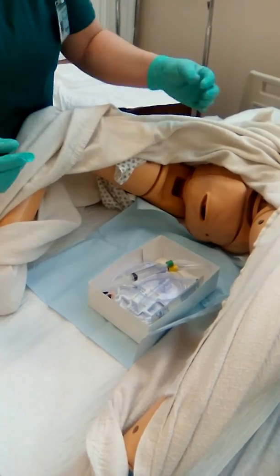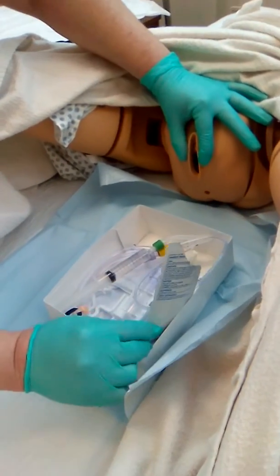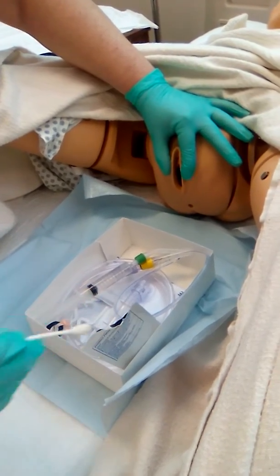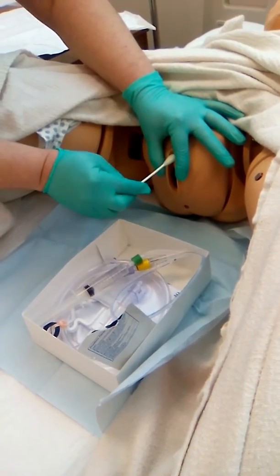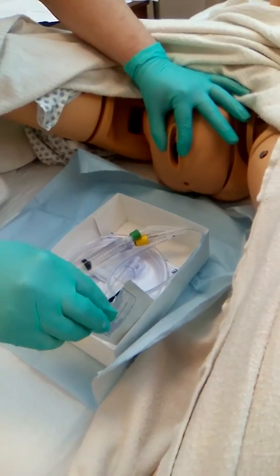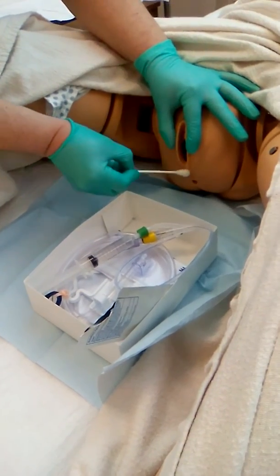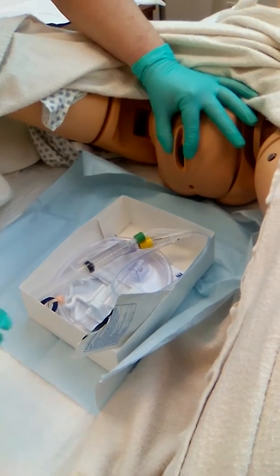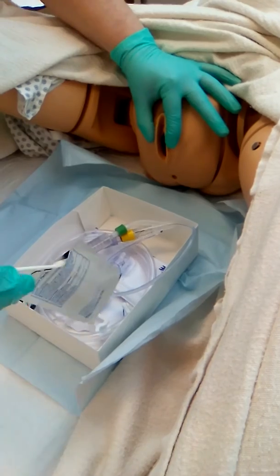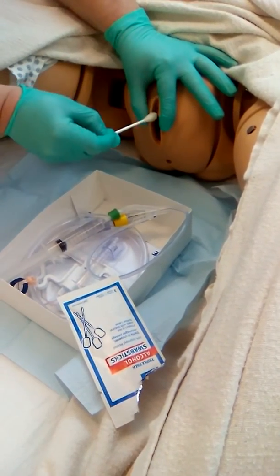I will then cleanse the urinary meatus. I will separate the labia. I will clean one swab down. One swab this way. And one swab down.